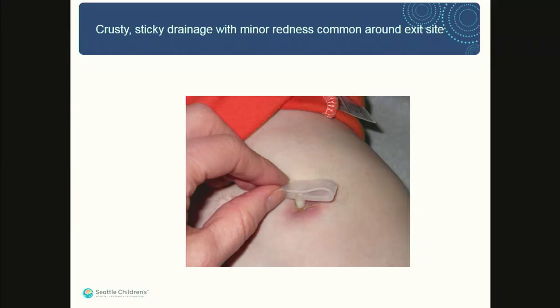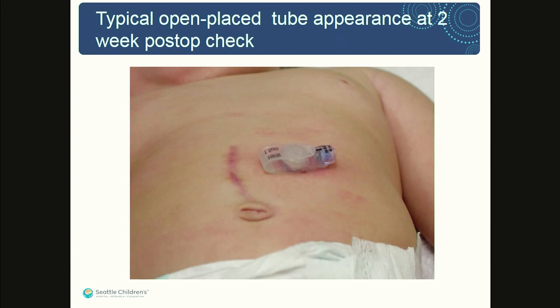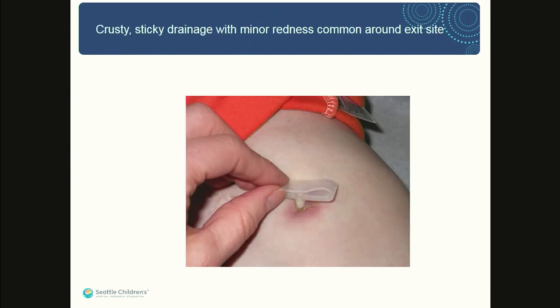Here's a button with a little bit of red and a little bit of crust, and that just looks great to me. I don't see any problems there at all. Let's back it up just a second. So you see how much stem shows there? People are like, oh, that's too loose, that needs to be downsized. Nah. Loose tubes are really good.